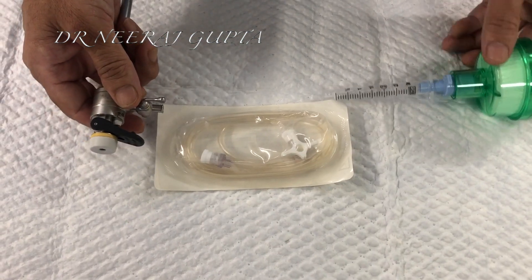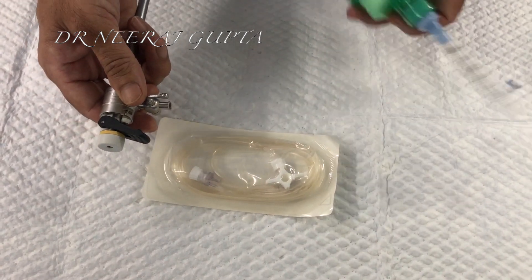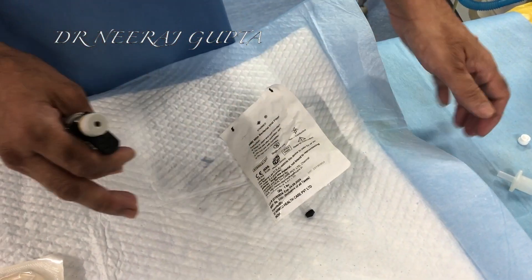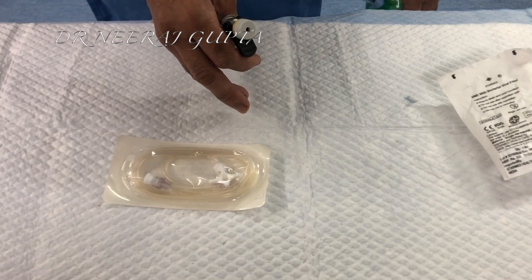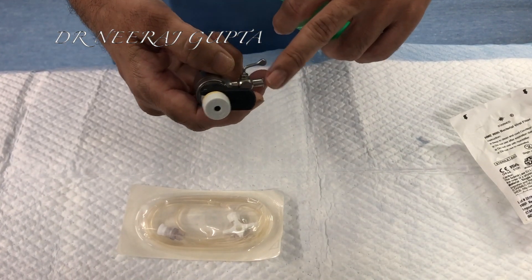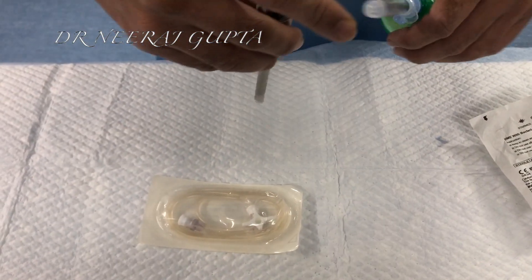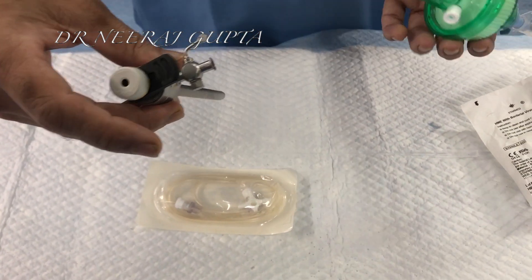Once the tubing is attached, it is very easy for it to be kept anywhere. You can even keep it under the drape of the patient or anywhere so that the gas does not come to us, or we can just fix it to our drape. There is no traction on the port, so the port is free to move and this is lying separately without disturbing our surgery.